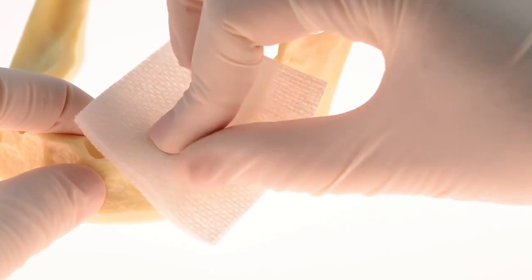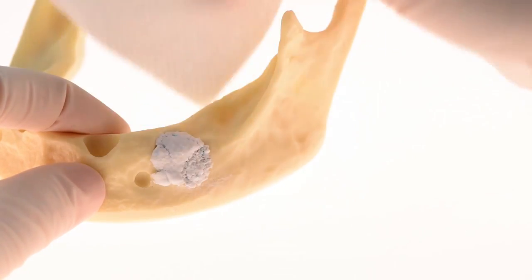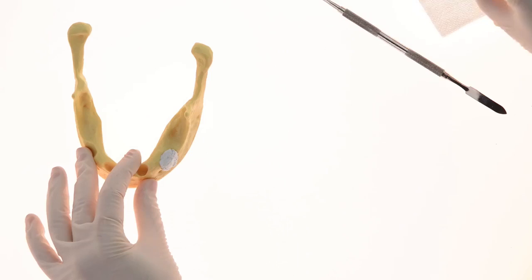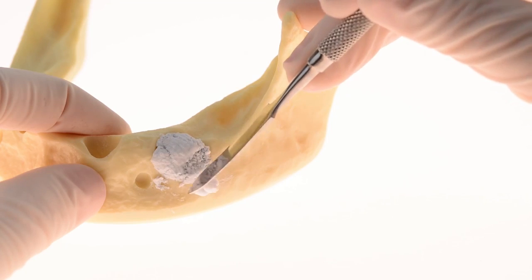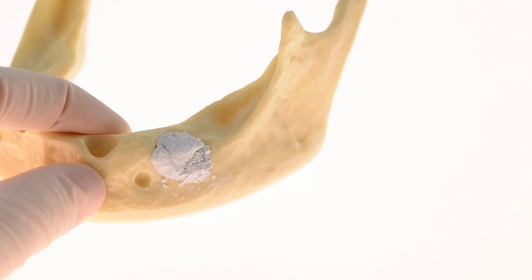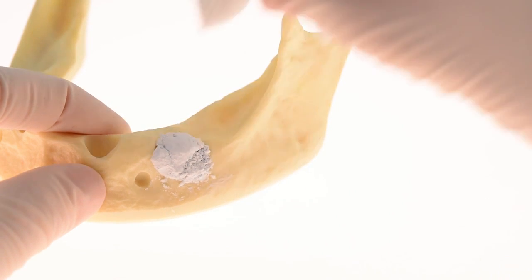Now firmly press on the material with dry gauze for 3 seconds. Slightly shape the material if required, and then press again on the material with a dry gauze for 3 seconds.